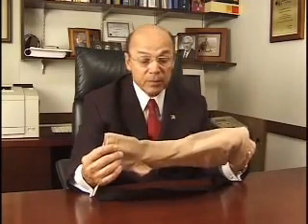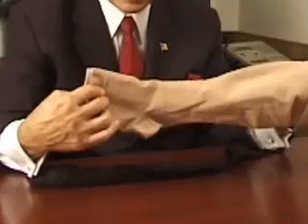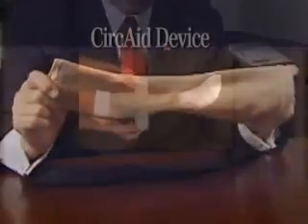Since these stockings are rubber, sometimes one has to put a nylon understocking in order to prevent allergy to the stocking when it's used every day.